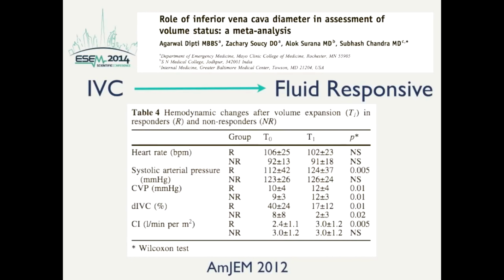A meta-analysis of 5 studies concluded that a moderate level of evidence suggests that the IVC diameter is consistently low in hypovolemic status when compared to euvolemic status. This table is from one of the studies included in this meta-analysis. The study was done in an ICU setting with 23 ventilated patients who were septic. Measurements were performed at baseline and after volume expansion.